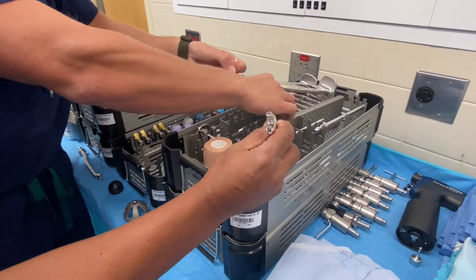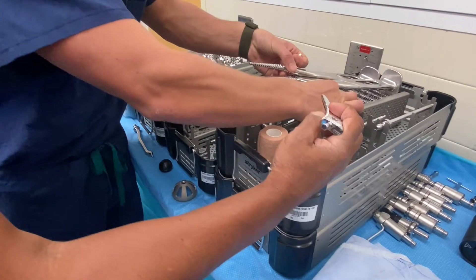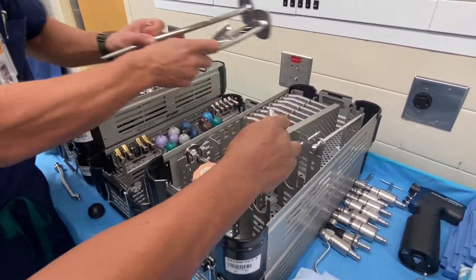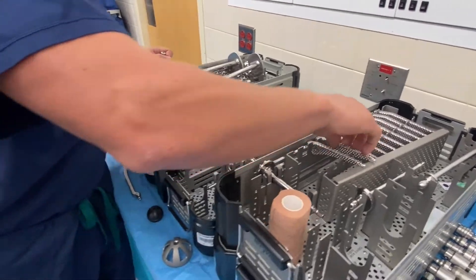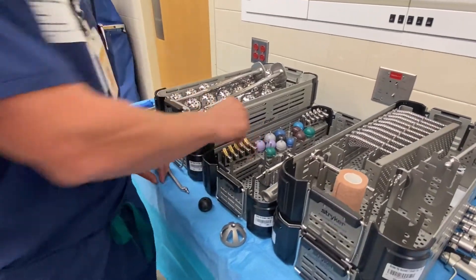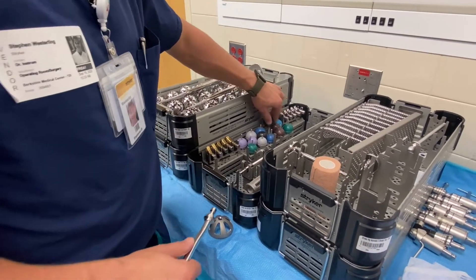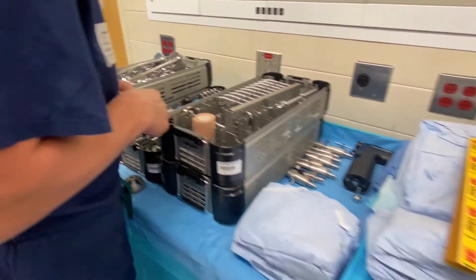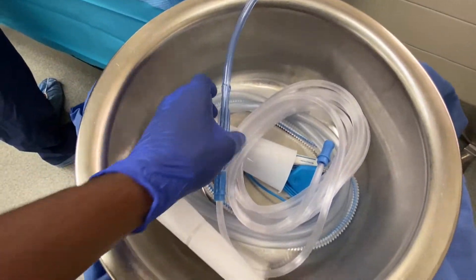So we pull this one out — it's a six, so that's blue. It's a three depending on what size. It's just color coded. All right, thank you.